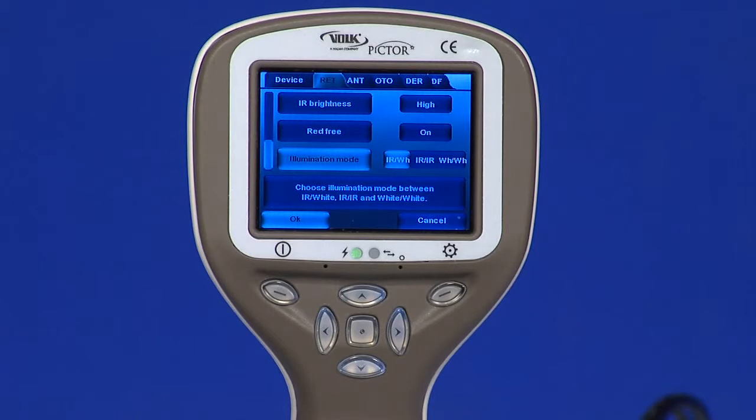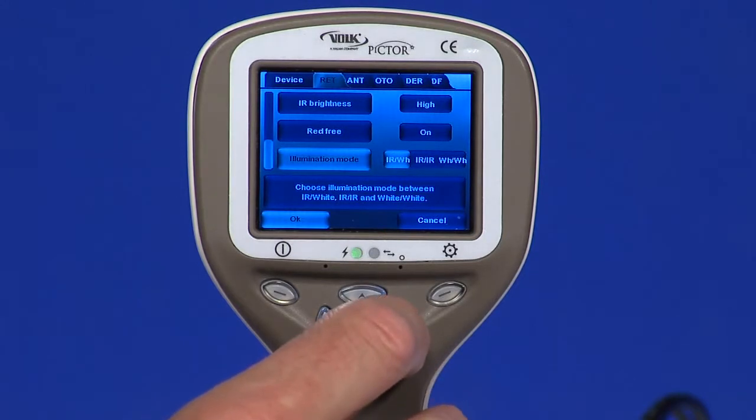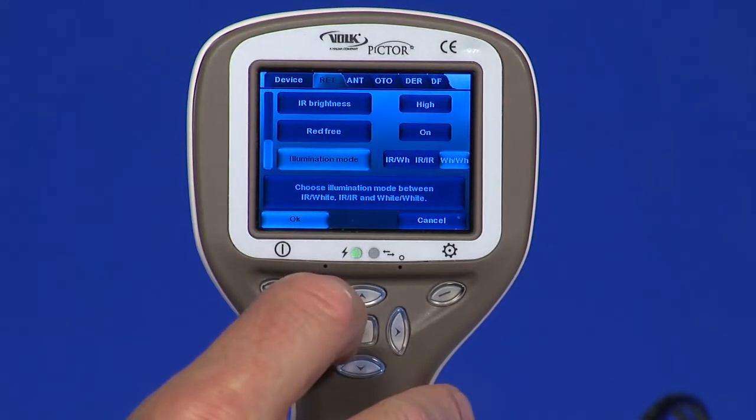Illumination mode. Use left and right arrow keys to select aiming and capture light source. Higher illumination settings are recommended for darker retinas.